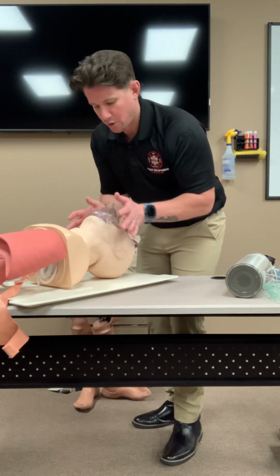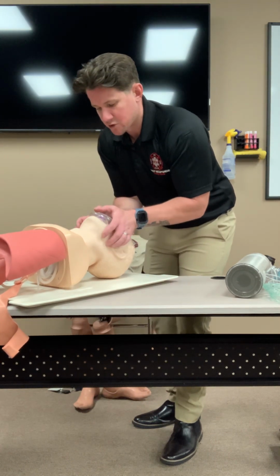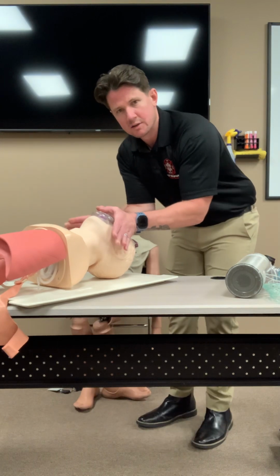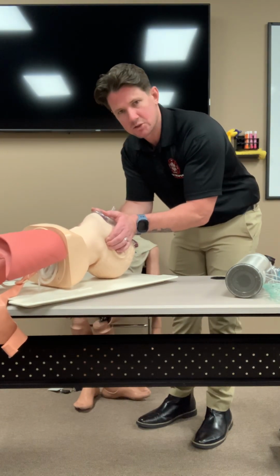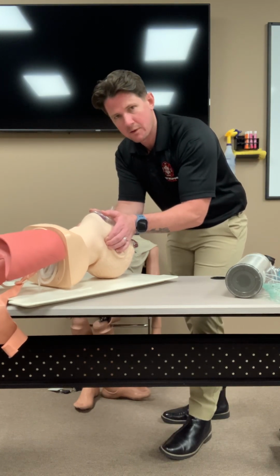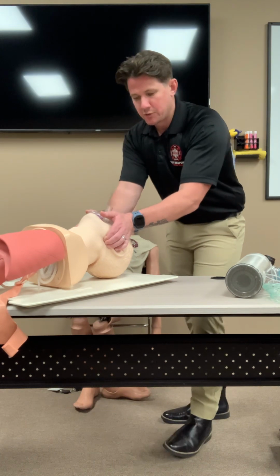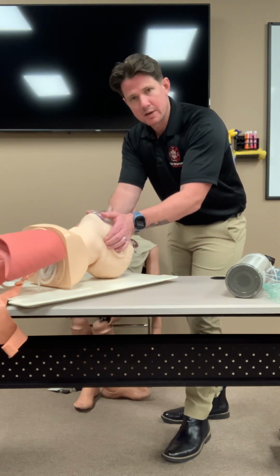So this is going to give me light pressure in, but it gives me all my fingers to really grab the angle of that jaw. Take these and pull the face into the mask. That is the goal. We want to pull the face into the mask, okay? And if you guys could see it, you would see how beautifully open and patent this patient's airway is.